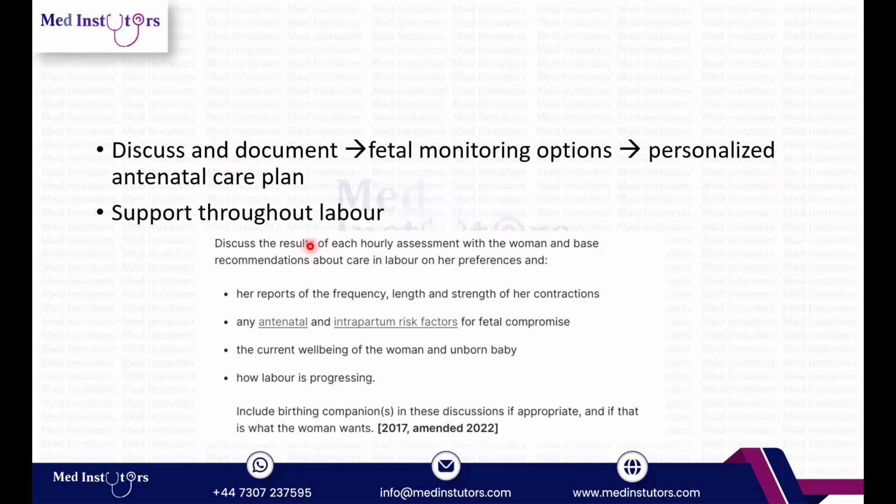Okay. You have to offer her support throughout labor, and you have to tell her that this is something very dynamic, which can change if new risk factors come up, or if the risk factors that had come up have settled down, and it can even be stepped down from CTG to auscultation.